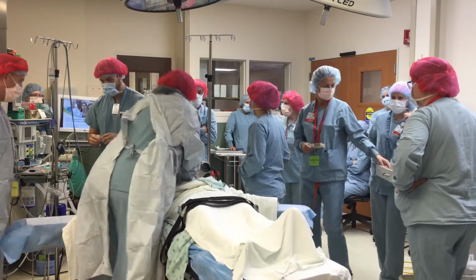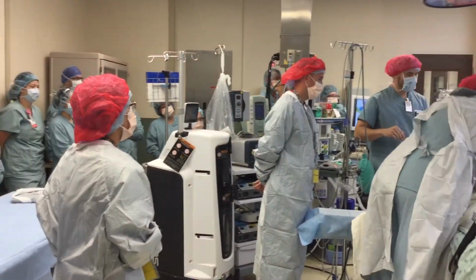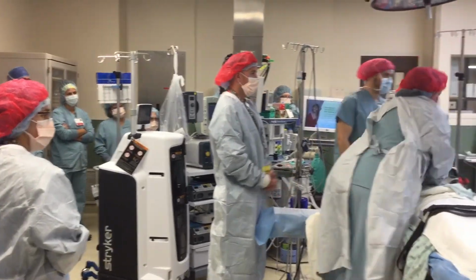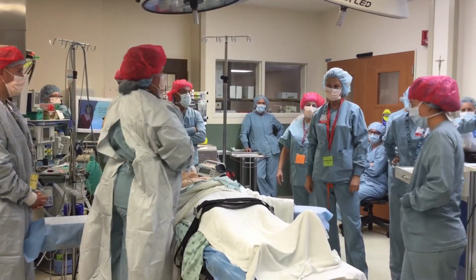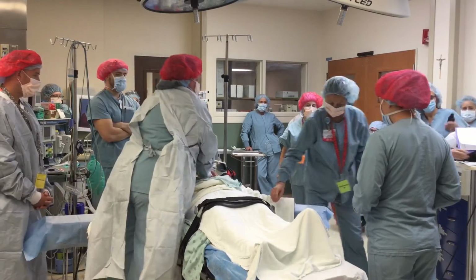We need a first amp of epinephrine please to go in. Are the shocking pads ready? Are we ready to shock? Charge please to 200. Charging to 200 joules. Let us know when it's ready please. Continue CPR.